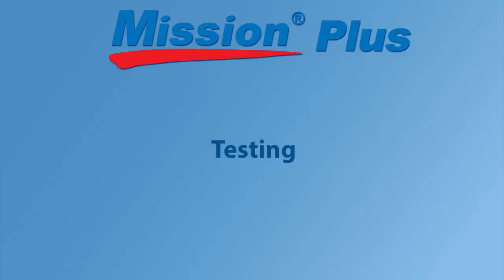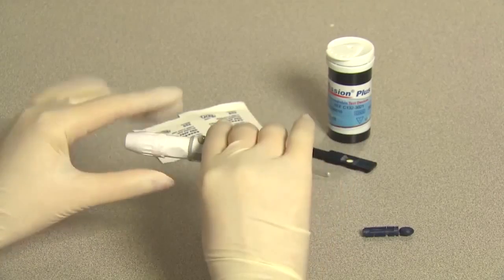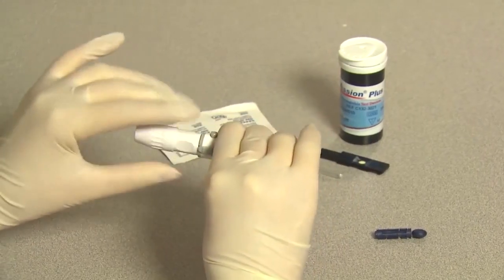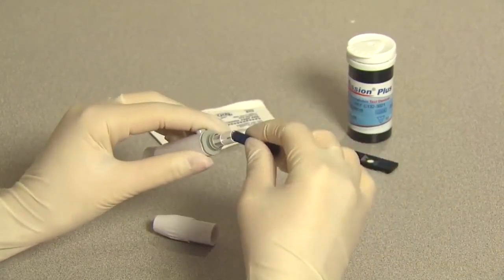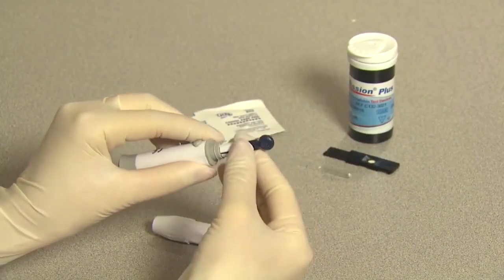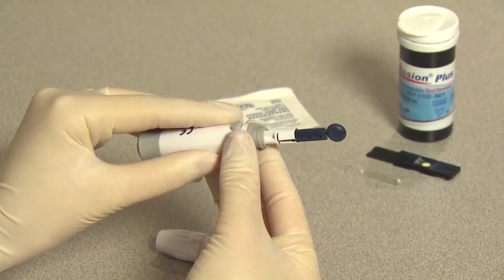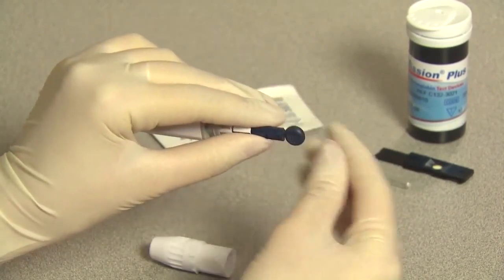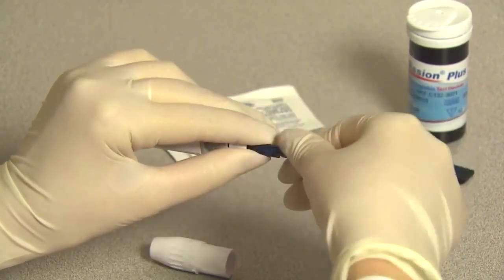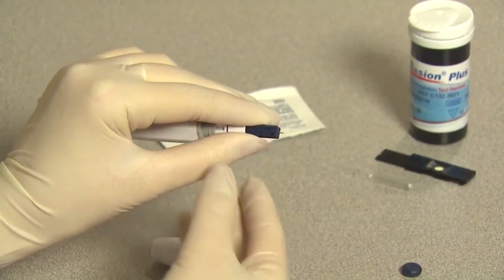Testing. In this section, we will show the testing procedure in a professional environment. Unscrew the lancing device cover from the body of the lancing device. Insert a sterile lancet into the lancet holder and push it until the lancet comes to a complete stop in the lancet holder. Hold the lancet firmly in the lancet holder and twist the safety tab of the lancet until it loosens. Then, pull the safety tab off of the lancet.